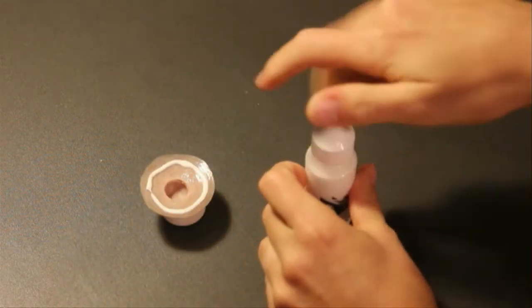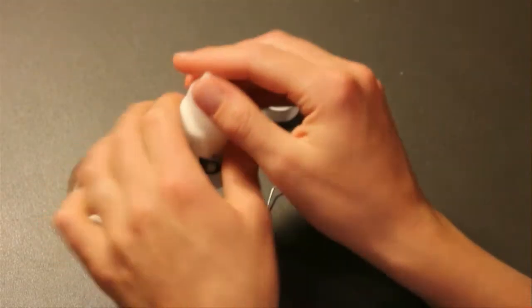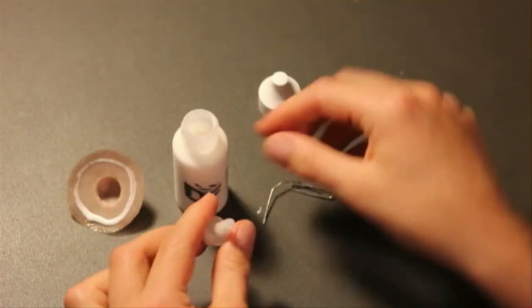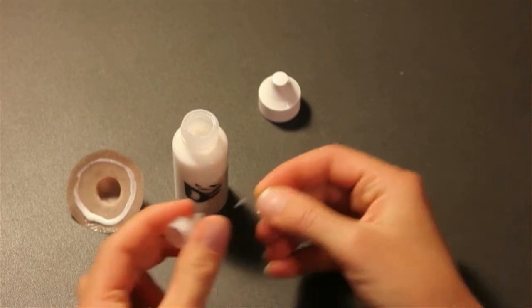If the adhesive dropper clogs, insert a paperclip from both sides to clear it. If desired, a cotton tip swab can be dipped directly in the bottle.